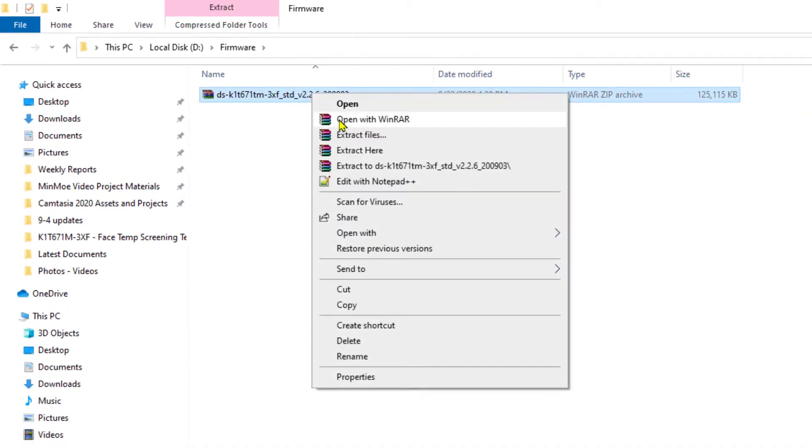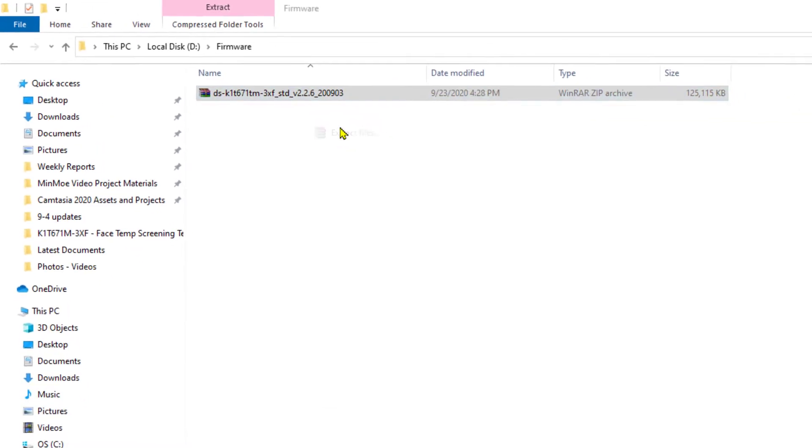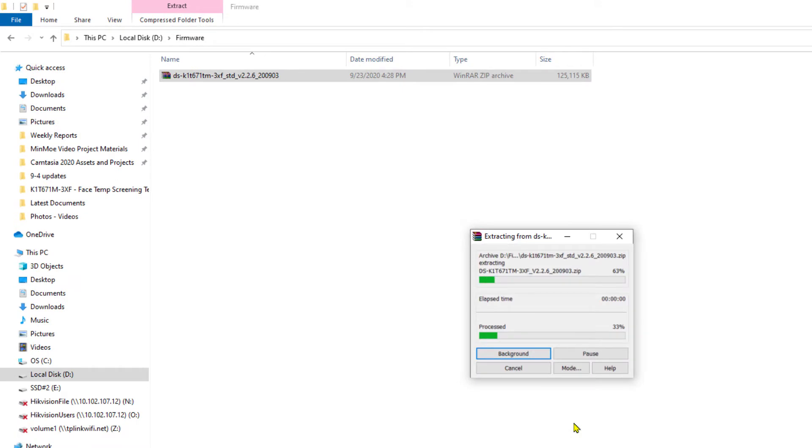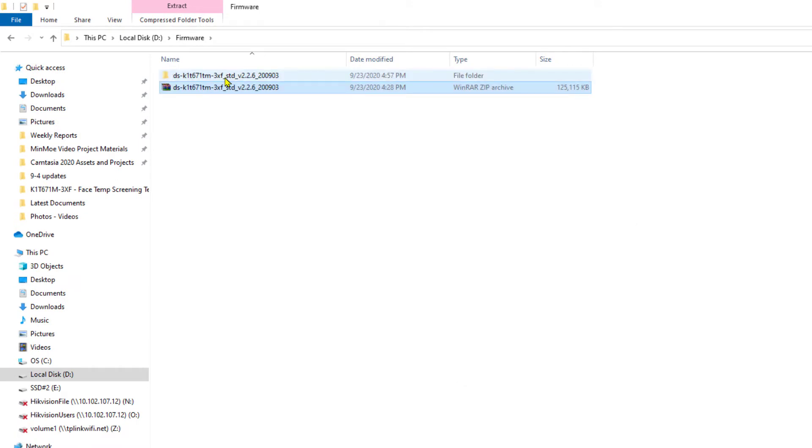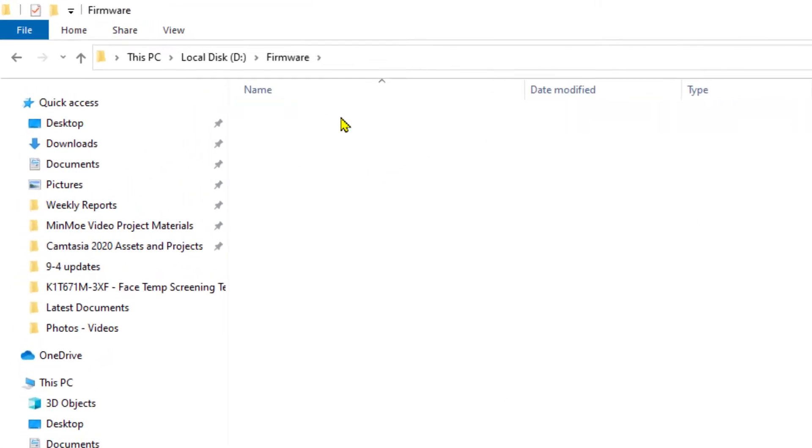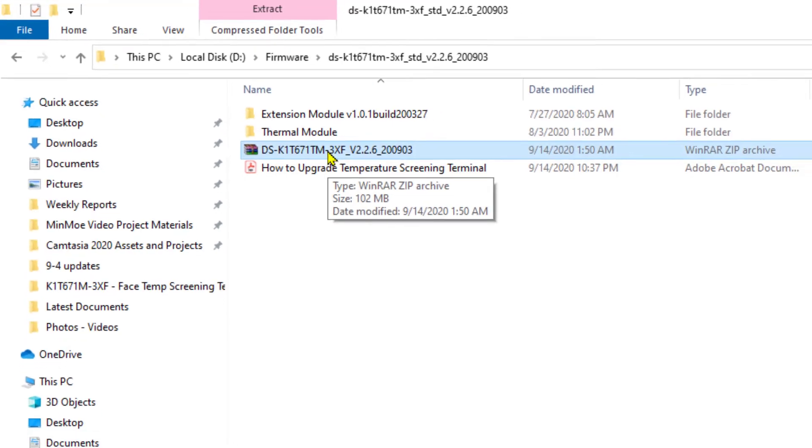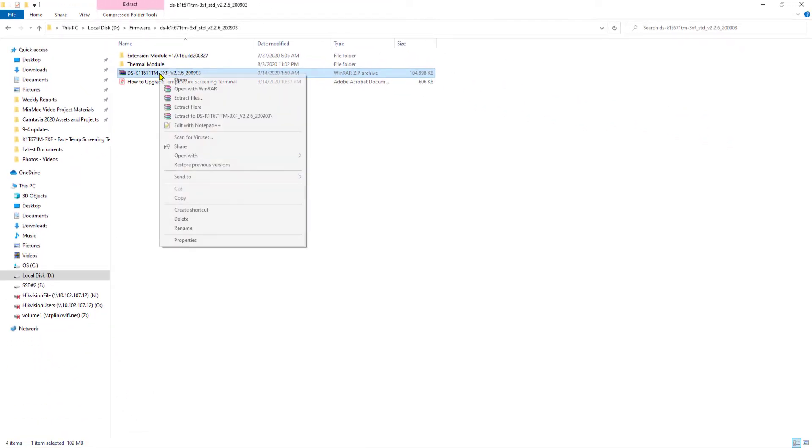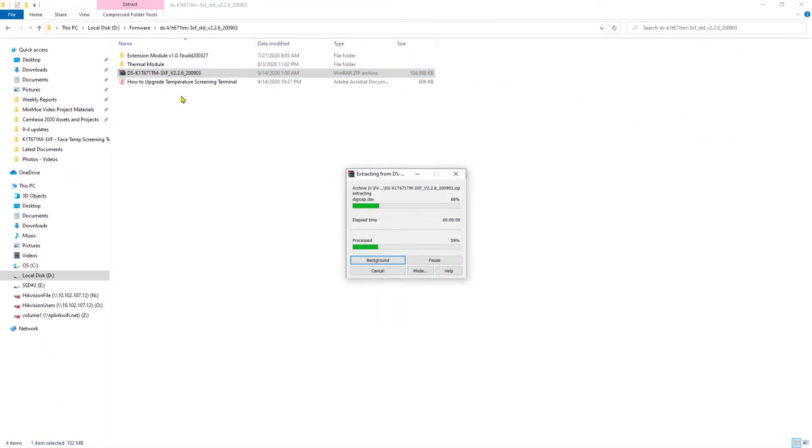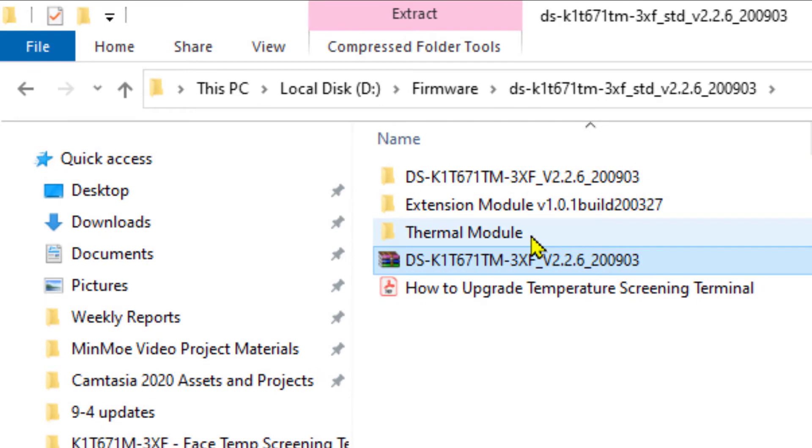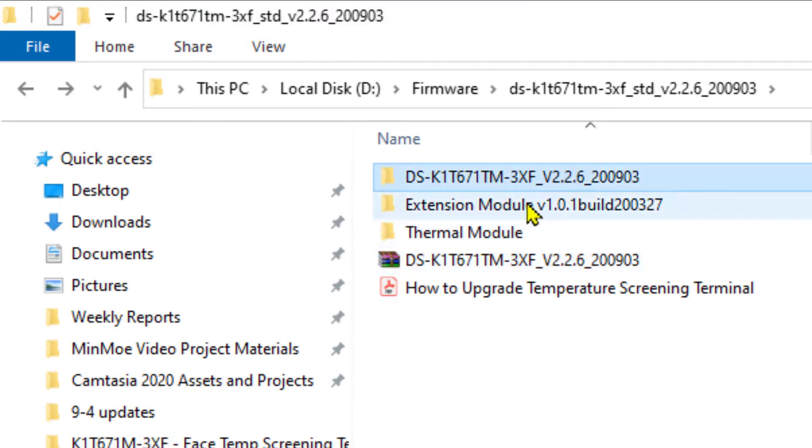I'm going to go ahead and extract those files right here, and I get this folder. If I look inside of that folder, I have one, two, but not the third file that I'm looking for. It's actually zipped, so I'm going to have to unzip this file as well, and now I have three different portions of my firmware upgrade.